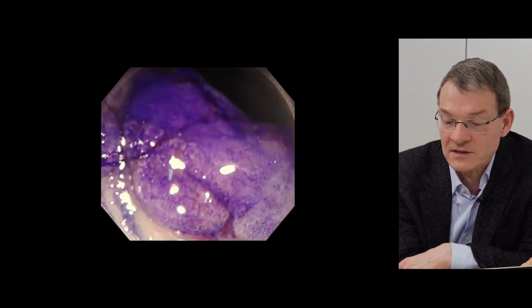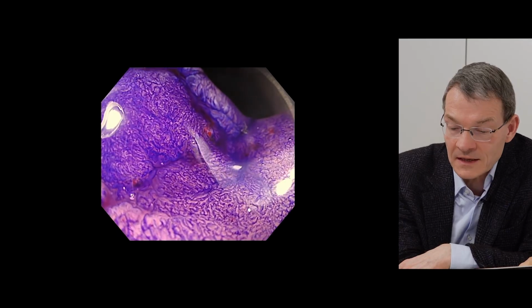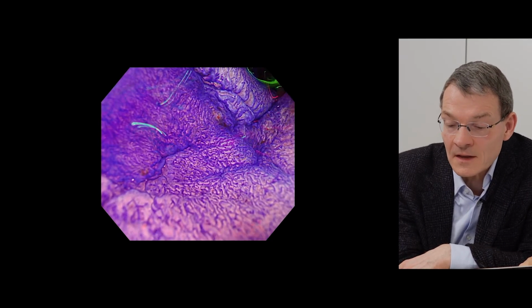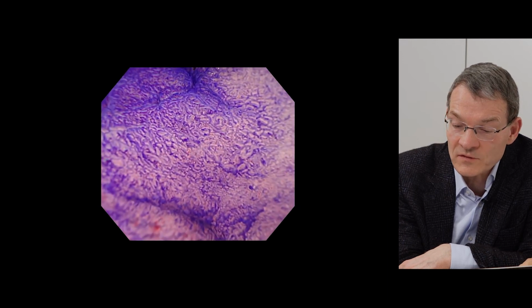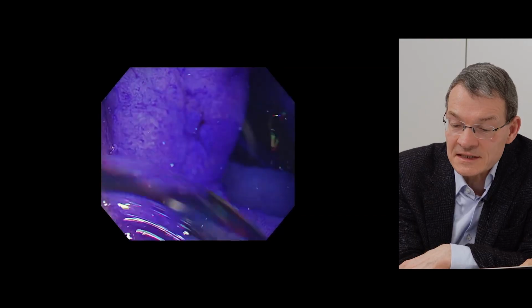First, I would like to show you crystal violet. This is now first the central area. And here, this is very nice. Always when you do imaging, we do this underwater. You have it more sharp and more precise.